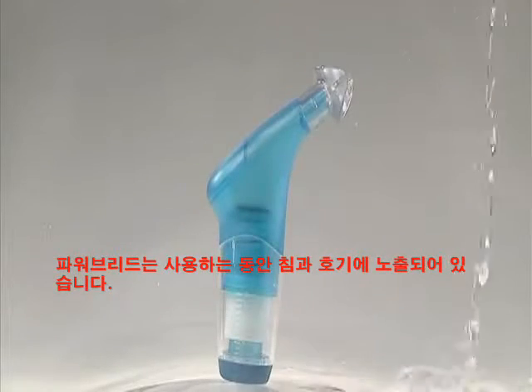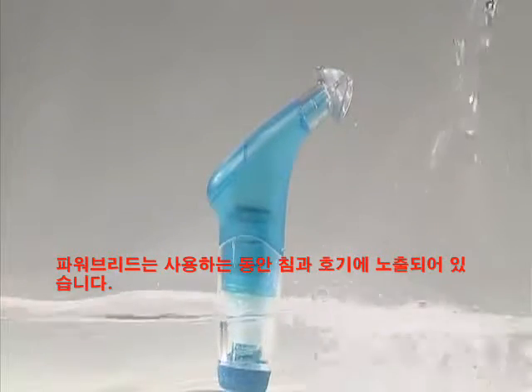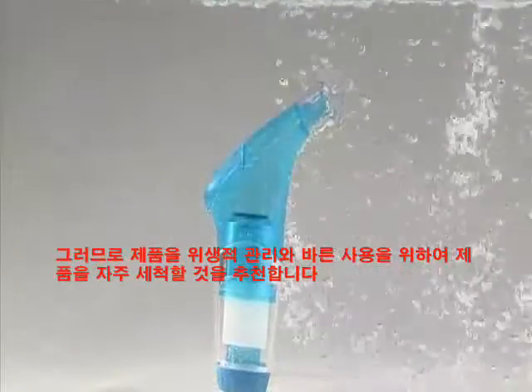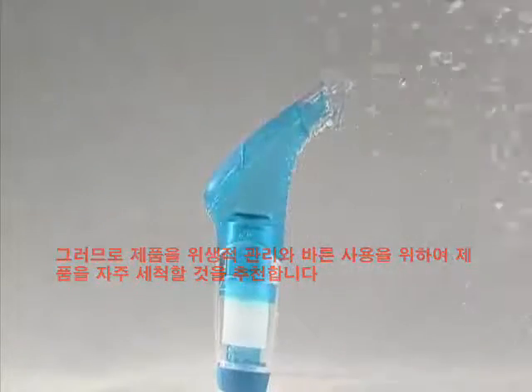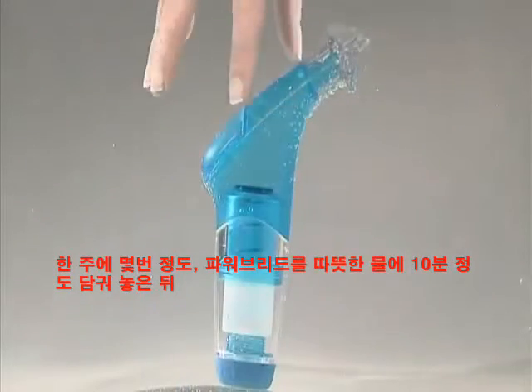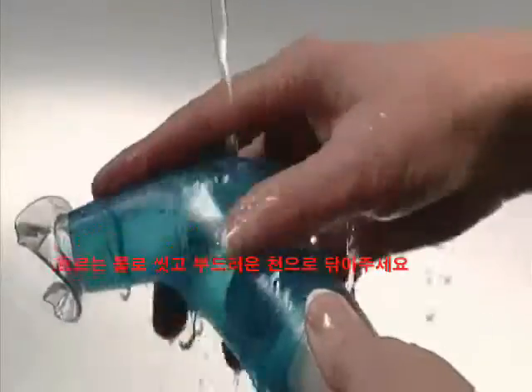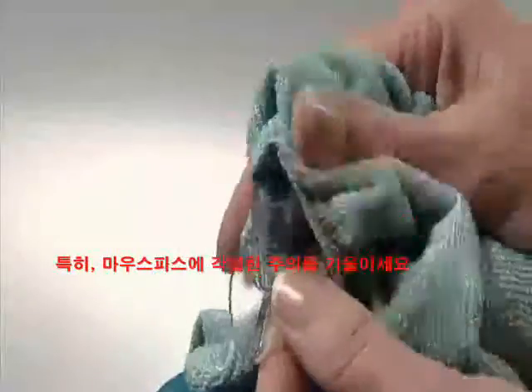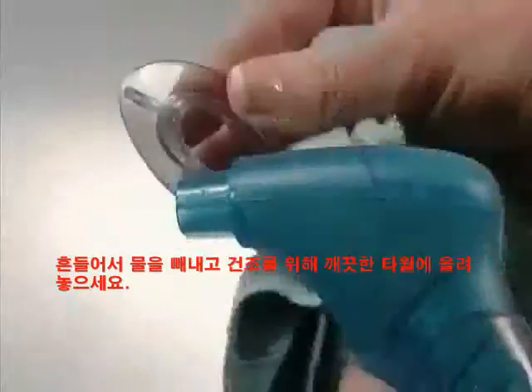Your PowerBreathe is exposed to saliva and exhaled air when it's being used, so we recommend cleaning it frequently to keep it hygienic and in good working order. A few times a week, soak your PowerBreathe in warm water for about 10 minutes and then wipe with a soft cloth under running water. Pay particular attention to the mouthpiece. Shake off excess water and leave to dry on a clean towel.